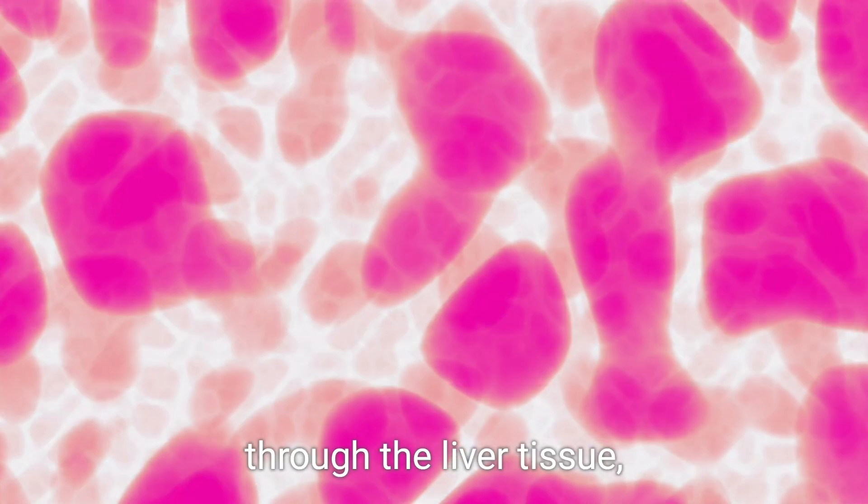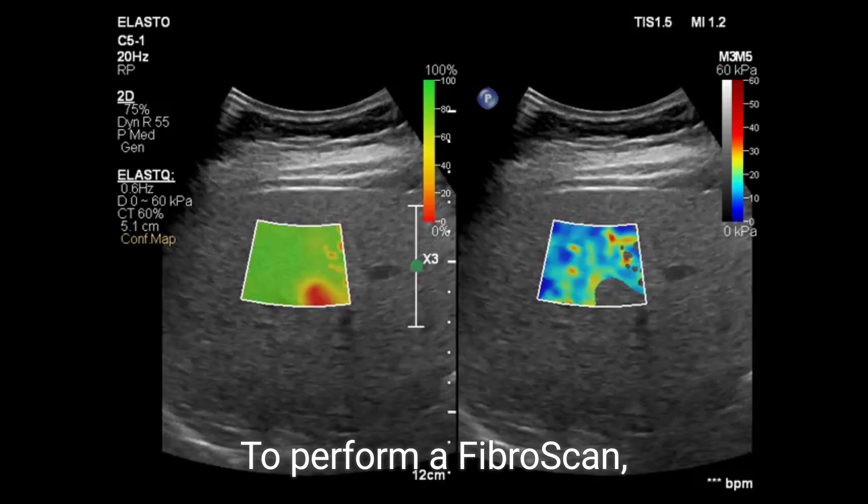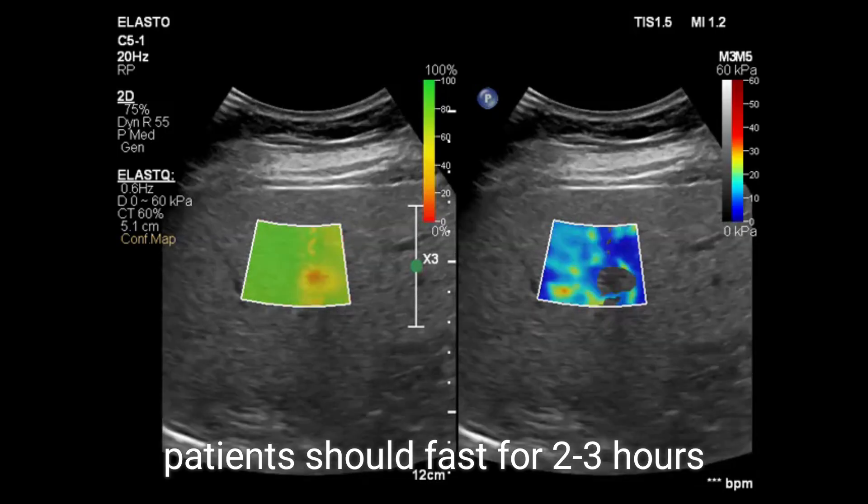Fibroscan determines the speed of the shear wave passing through the liver tissue, which is directly correlated with its stiffness.